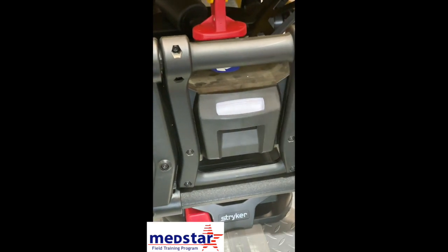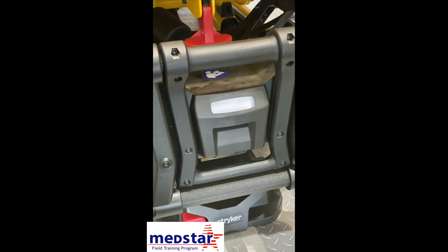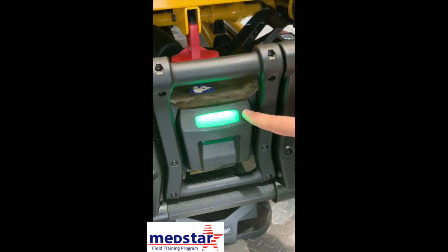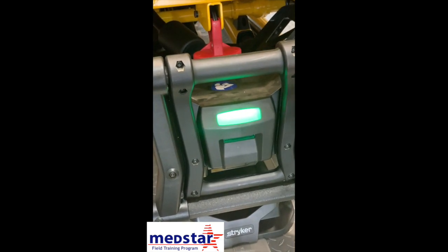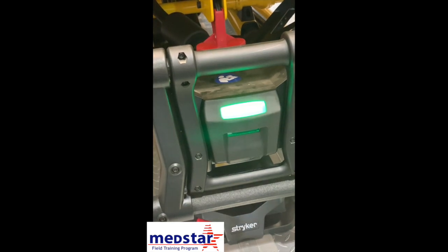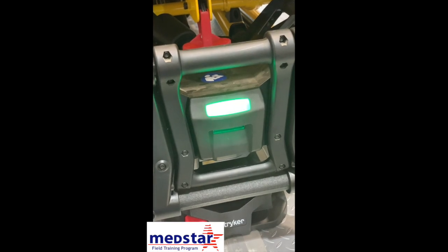The indicator light for the battery is not currently on because the stretcher is in sleep mode. If you touch any of the buttons, it will turn the battery power light on so you can check the battery. A green indicator light tells you the battery is charged and ready for use. If it turns yellow or is flashing yellow, the battery is losing power and needs to be charged soon, but you can still get some use out of it. If it's red or flashing red, the battery is about to die — change the battery as soon as you can.